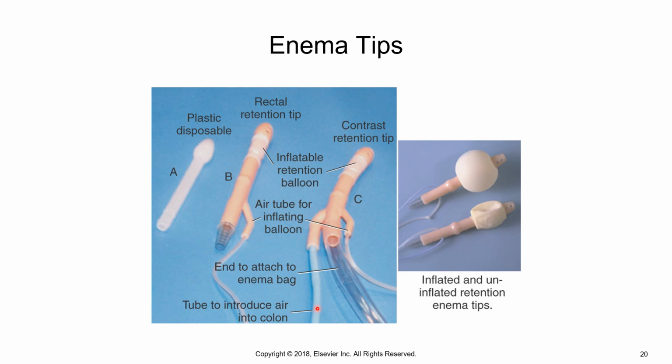So this one would go to the tubing to inflate the patient with air. It's got a bulb syringe attached to it. And this one right here, along with this one, those are what clamp off the air that gets put into the retention balloon. And here you can see this is completely deflated when we first get the tip, and then this one is when the tip is inflated.